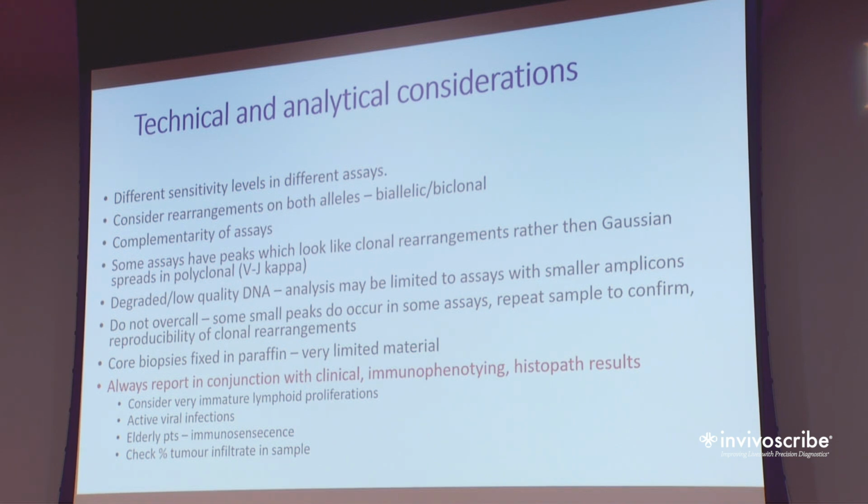Okay. Elderly patients, do watch out. Their immune system repertoire is getting less because of immunosenescence, so you can bring up peaks there. Also, I work in the National Adult Transplant Unit, and sometimes we would get queries as to, is this a query post-transplant lymphoproliferative disorder?